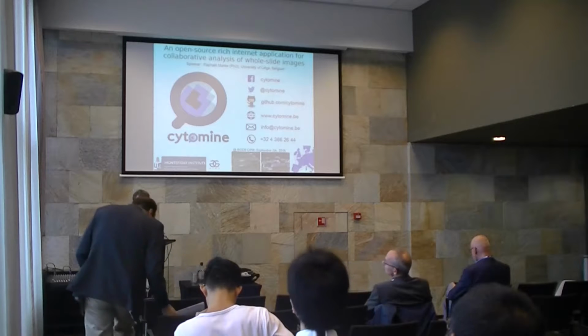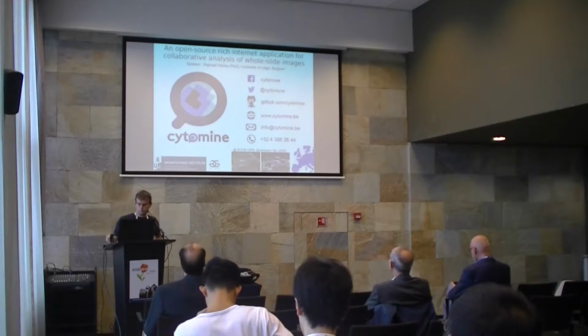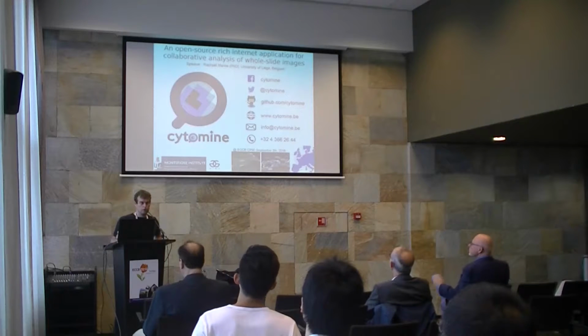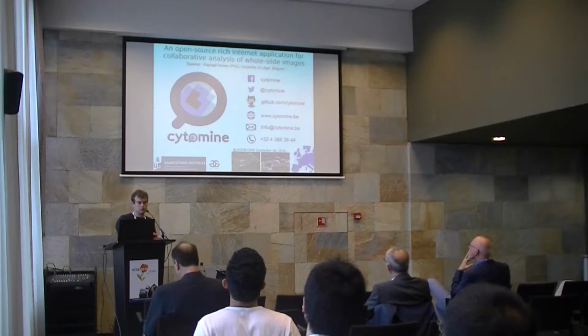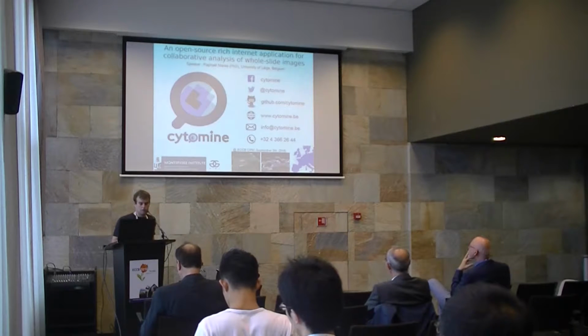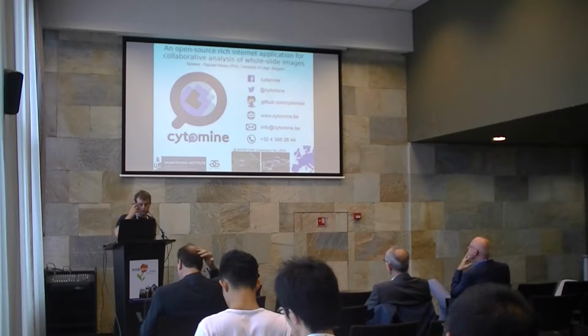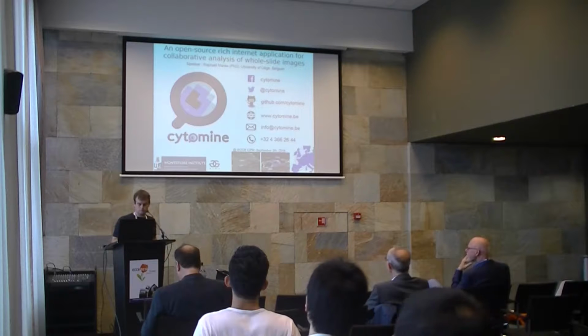Years now. It is called Cytomine. When we started this project, the goal was really to develop a software that will ease the collaboration between pathologists, biomedical researchers, and computer scientists. This software is fully open source and available to everyone, and I will present you its main features.